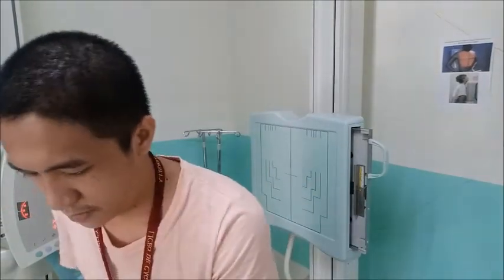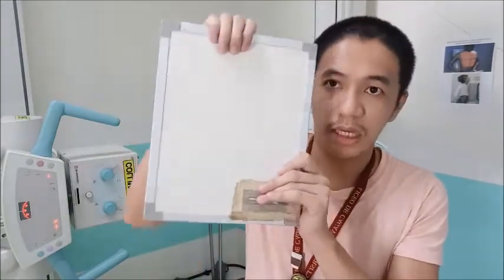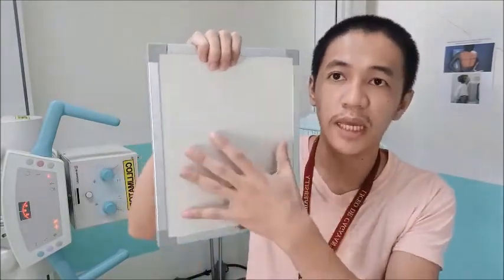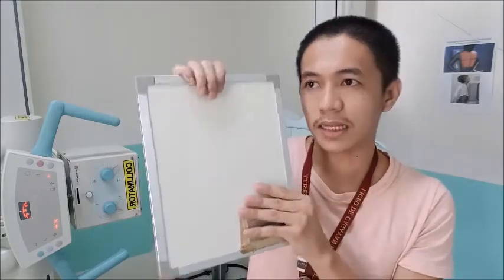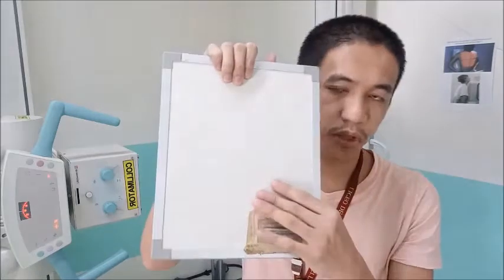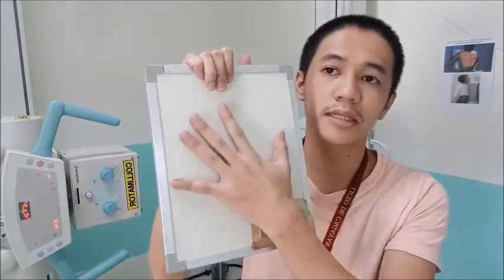Okay. If the patient is a newborn and you are dealing with conventional radiography, we can use the 8x10 cassette, for AP and then lateral. For a newborn, you can lay the patient down on the cassette.